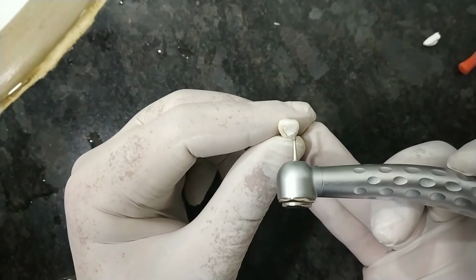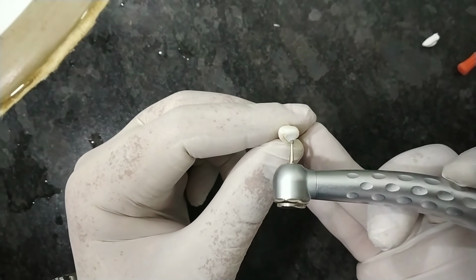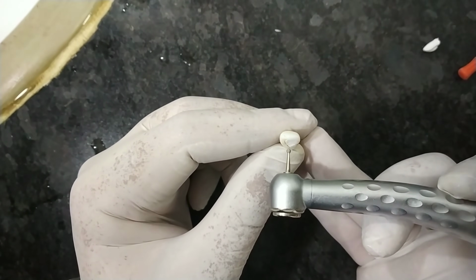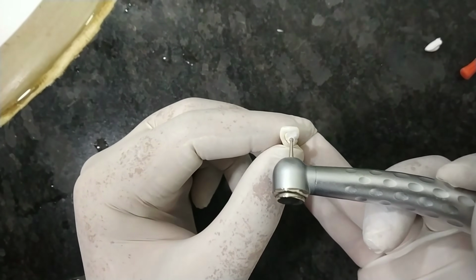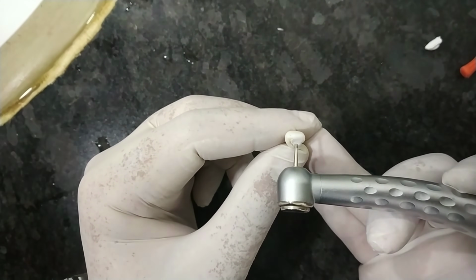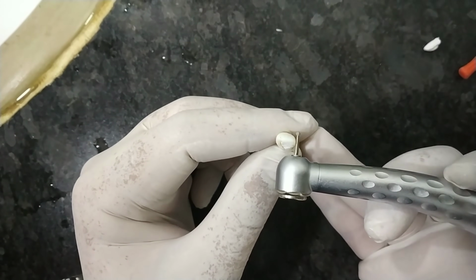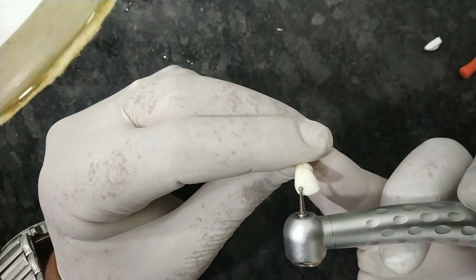Whenever we are approaching the root canal of that particular tooth, we have to approach from the palatal aspect of the tooth and punch a hole on the center of the cingulum area. We should keep in mind that we should not go too much around this, otherwise there will be labial perforation, as I showed you in the CBCT of the particular tooth.